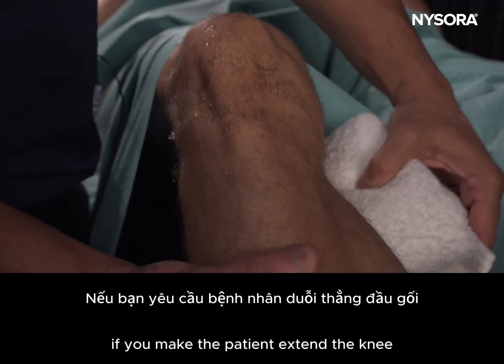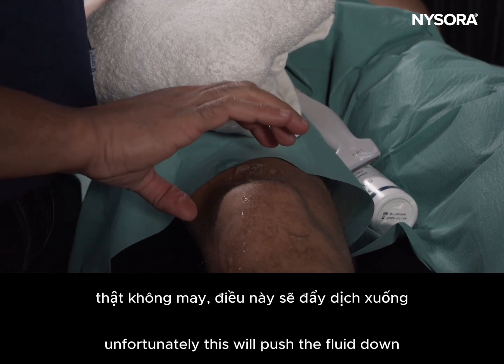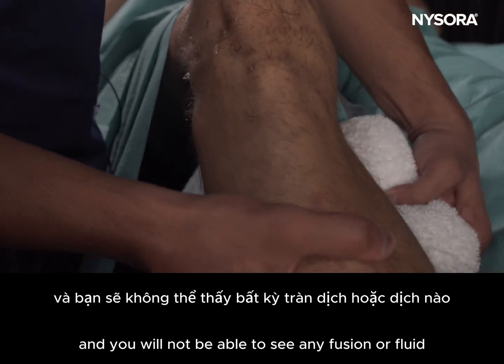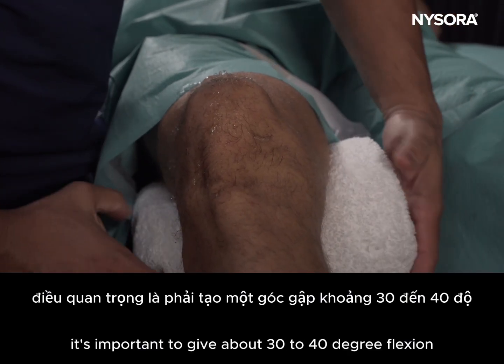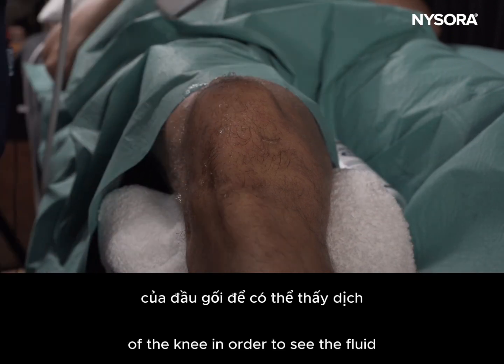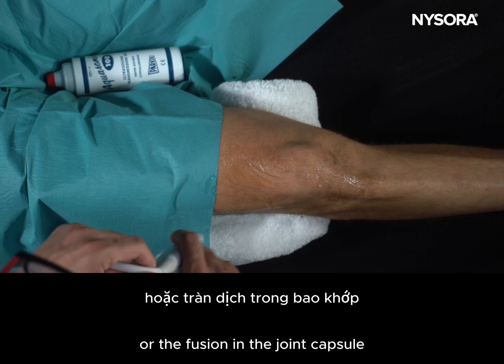If you make the patient extend the knee, unfortunately this will push the fluid down and you will not be able to see any effusion or fluid in the suprapatellar recess. Hence it's important to give about 30 to 40 degrees flexion of the knee in order to see the fluid or the effusion in the joint capsule.